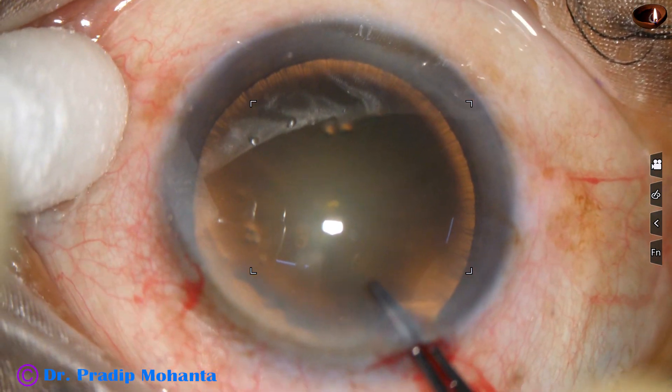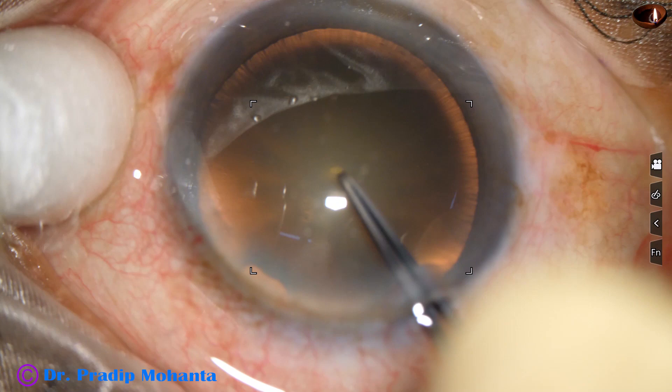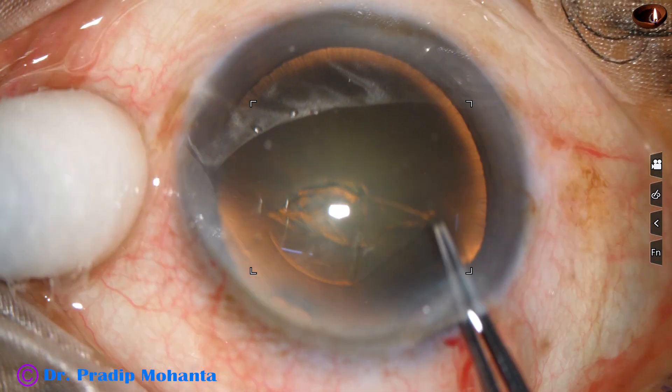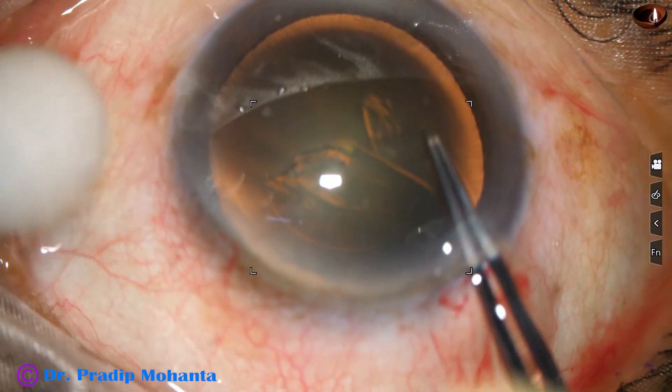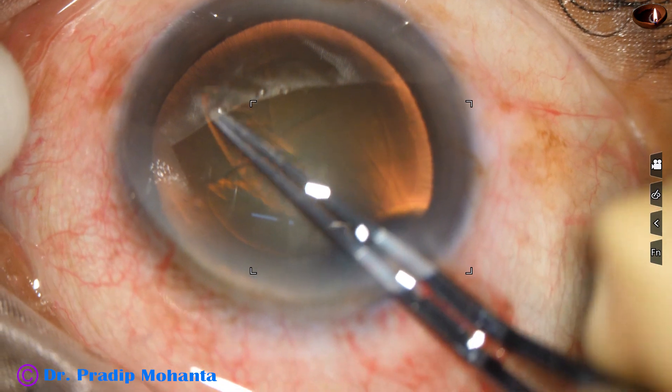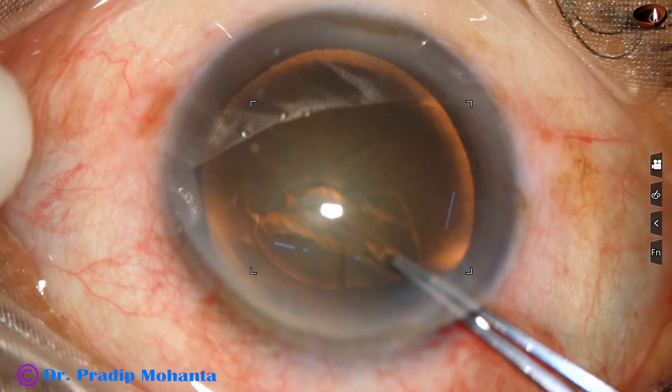Now capsulorhexis. Utrata forceps is being used to raise a capsular tag. This capsular tag is guided anti-clockwise all around to get an adequate size rhexis of about 5.5 mm.